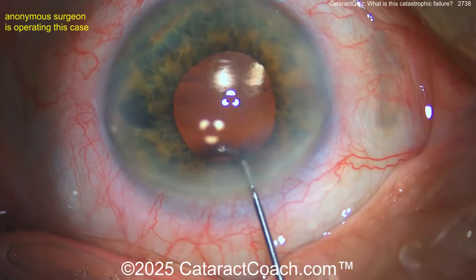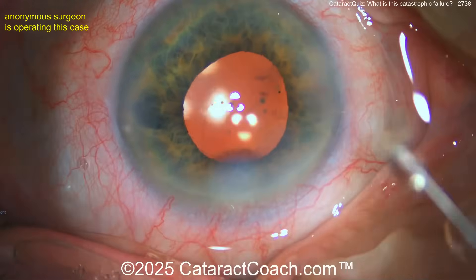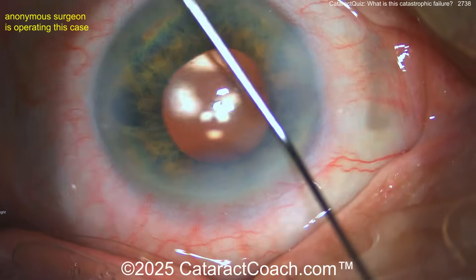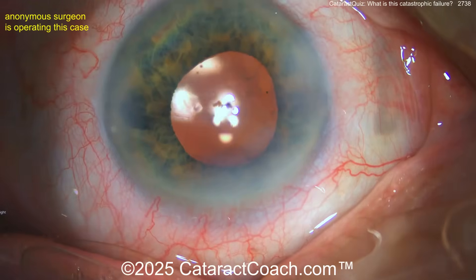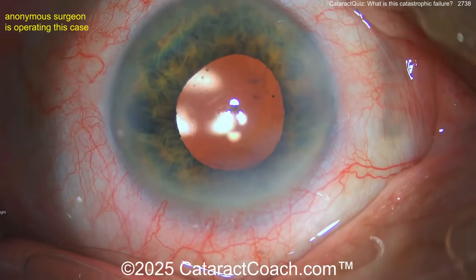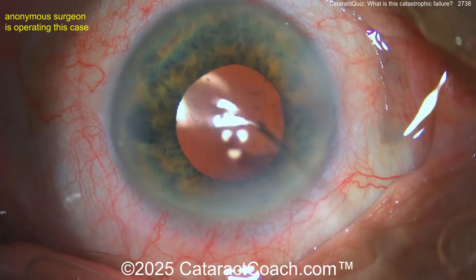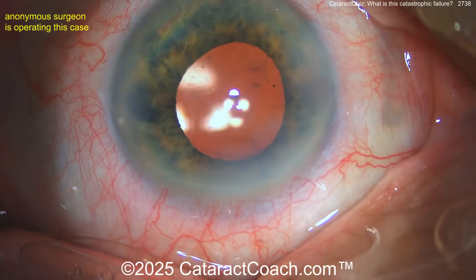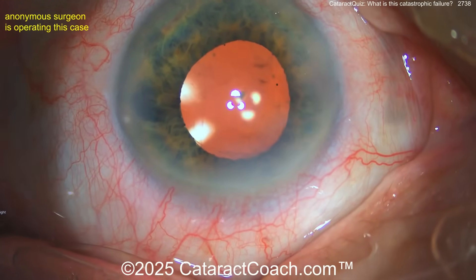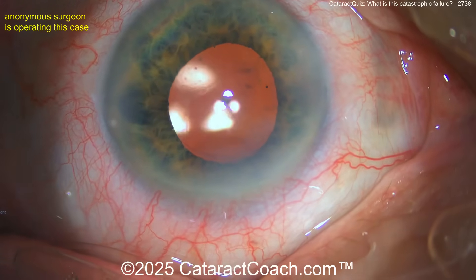That's Descemet's membrane — a huge detachment. If you don't get the air bubble in through the left paracentesis, this patient is going to need a bigger procedure. The cornea looks clear now, but it's going to be very edematous in the morning. The Descemet's detachment has now come across the central visual axis — it's a lot. That's a huge Descemet's detachment.